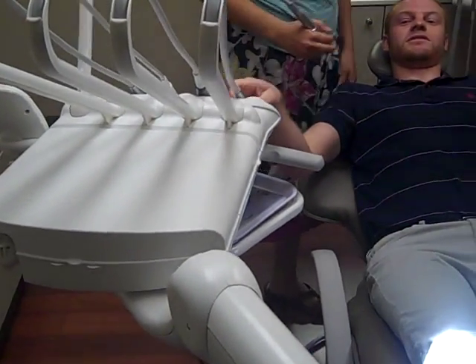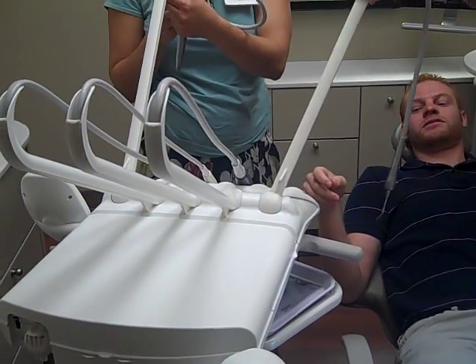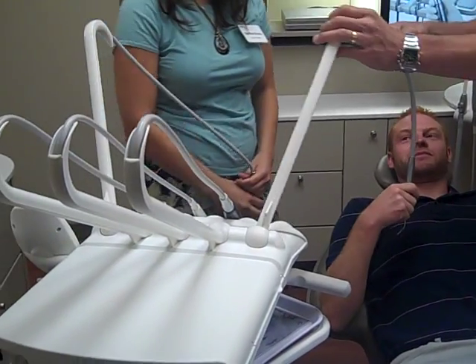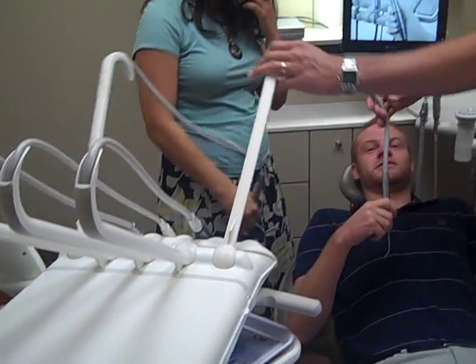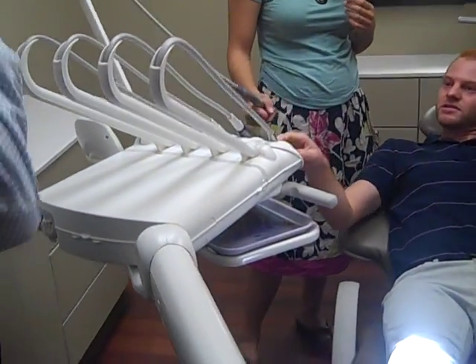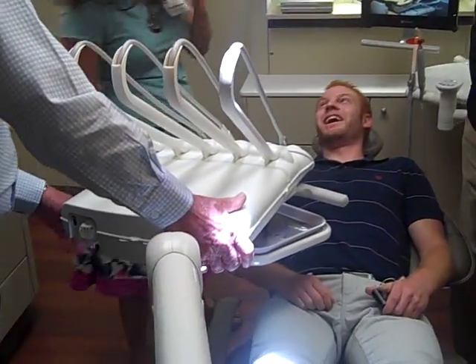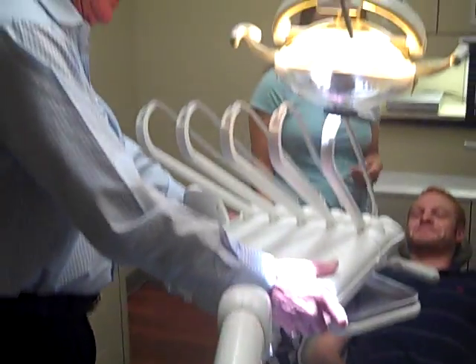Does it pull out? I think it does. But no, it doesn't. It's a little ball action, so you can go side to side as well. If you're going to use it thoroughly correctly, it's a trans-thoracic. So if that should be positioned... see? Apparently, we still don't want to do this sort of position.